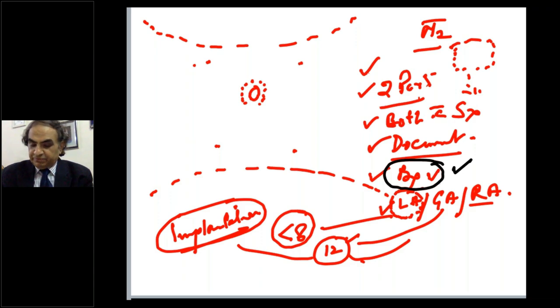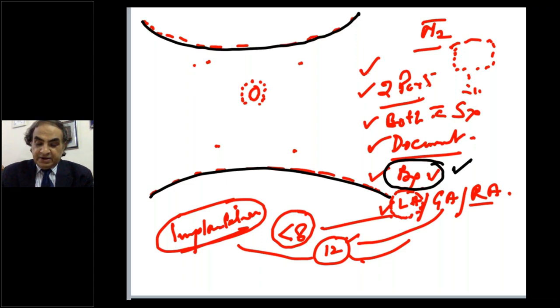So I've given you the port placement. Now, I've finalized it now. That's my patient lying supine. And importantly, this is the incision. If I'm going to the lower side, I'll prefer the incision above. If I'm going to the upper side, I'll prefer the incision below. Why? Common sense, no rocket science. I want to get a longer distance to work at, you know.